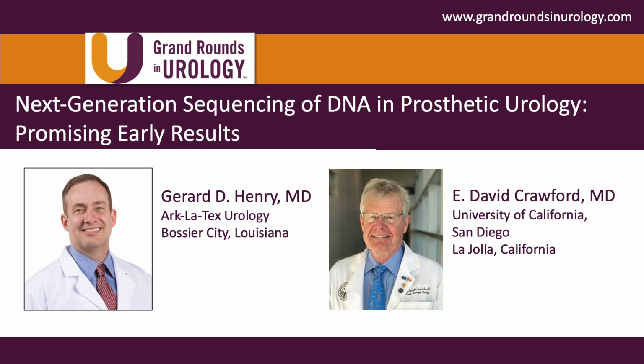So, well, thanks, Dr. Henry. That was very interesting and really is the future. So explain this a little bit in more depth. PCR is utilized and can be done if you have the reagents within your office to identify some of the more common bacteria. Is that correct? Yes, sir.